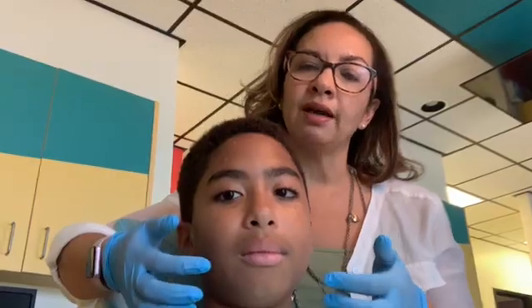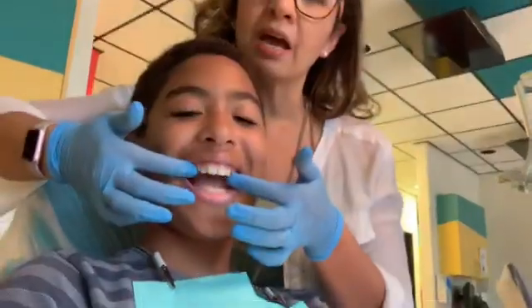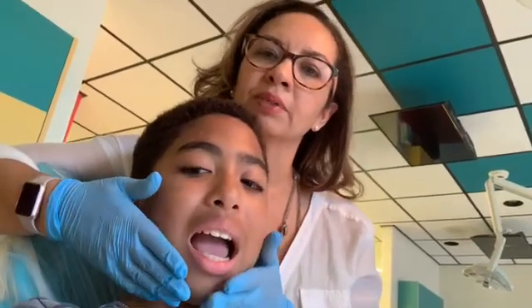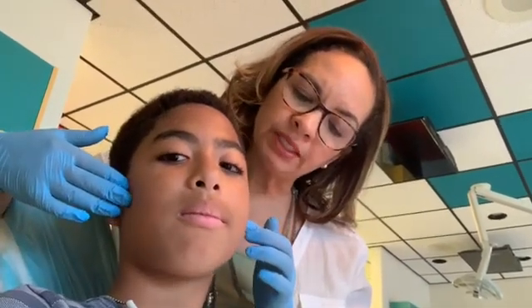A few things on how mouth guards protect not only the teeth but also protect from concussion: when we have the upper impression made, we'll have a final result of the rubber-based mouth guard that fits on the upper teeth only. The thickness of the rubber helps protect the sharp edges of the teeth to prevent lacerations to the lip, the tongue, and the cheek. It also protects against direct impact to the mouth and jaw.